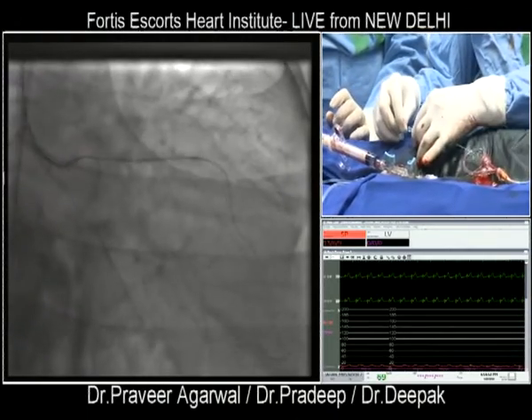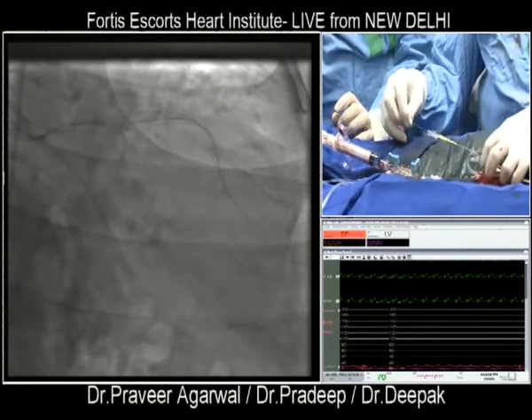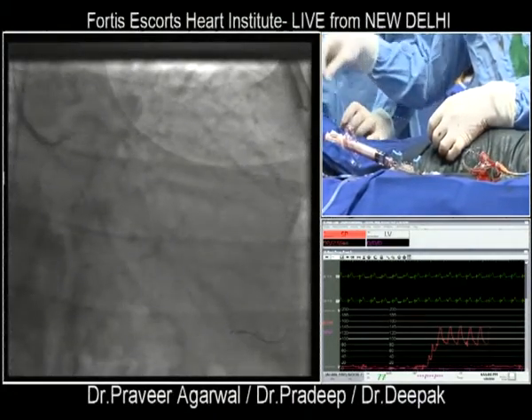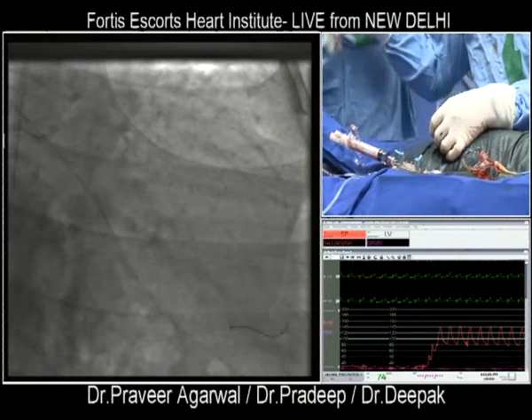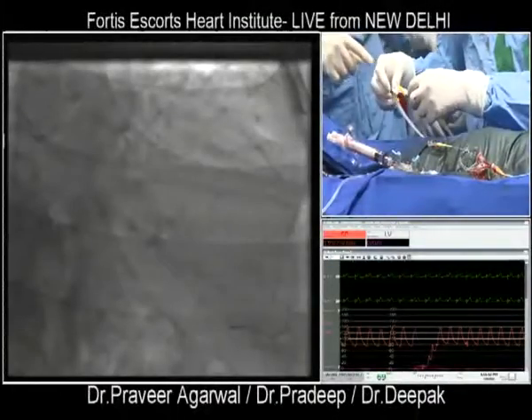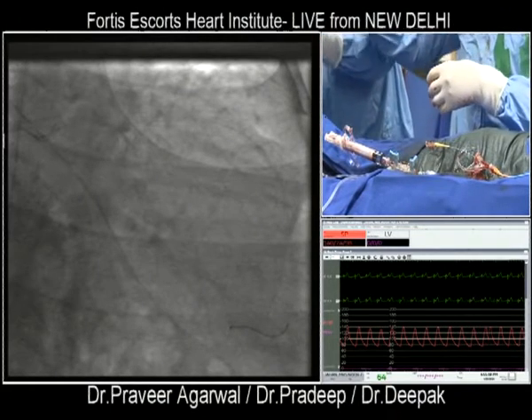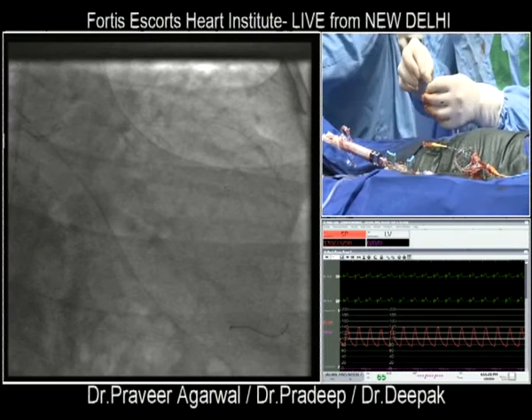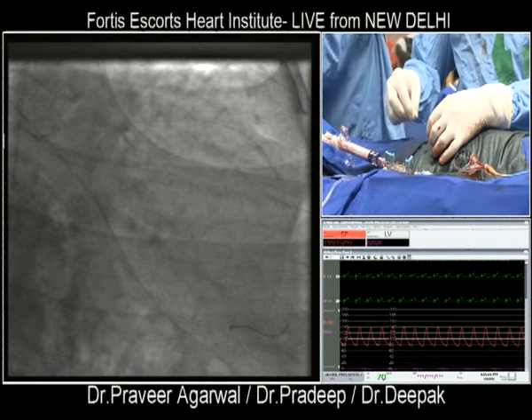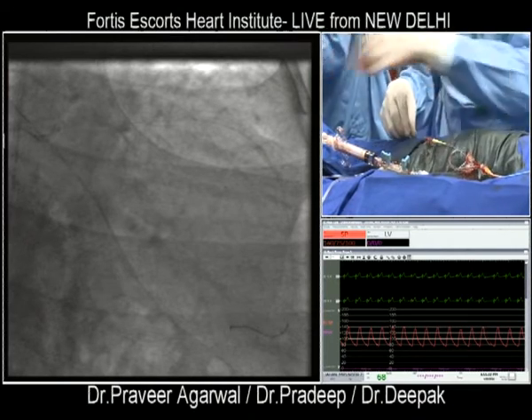I'm not holding the wire. It's not going. No, no, I'm not inviting. Just give me the BMW. Okay, I think BMW do. And a scoring balloon. First, I think we take an IVUS, so at least we can see the size of the artery.